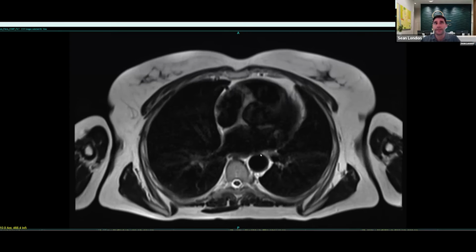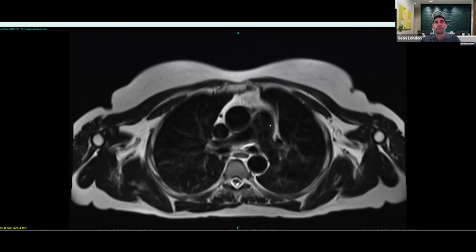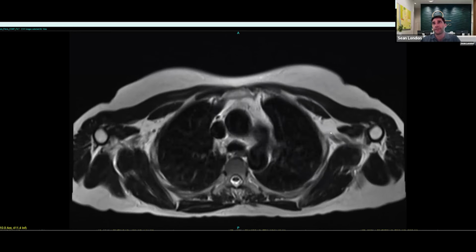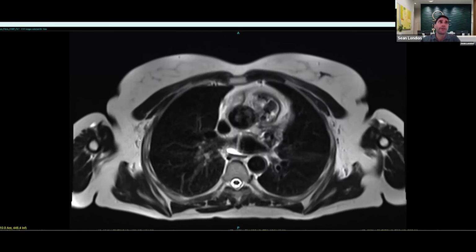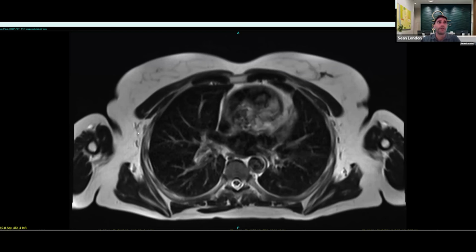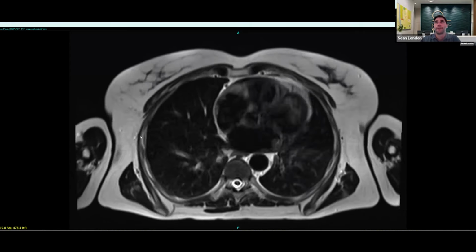And then just like I did in the neck, I'm looking for any abnormal lymph nodes that are centrally within the chest, and I don't see any abnormal lymph nodes. And I also look in the axillary regions, the armpits. Here's the left side and the right side, and I don't see any abnormal lymph nodes here. Generally, just because of the location here, people are able to feel any enlarged lymph nodes, but I don't see any here in this patient.